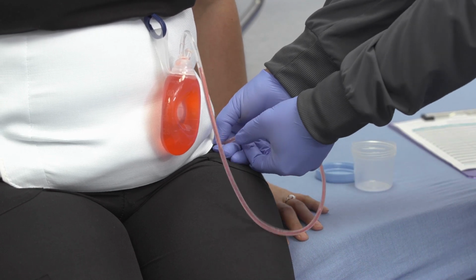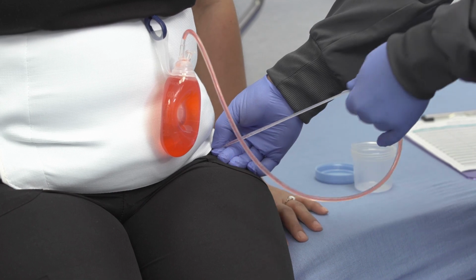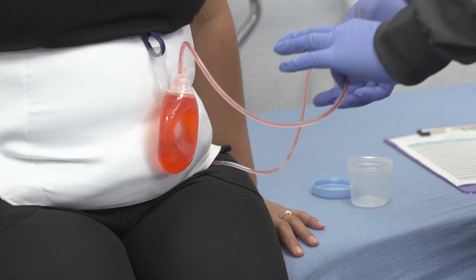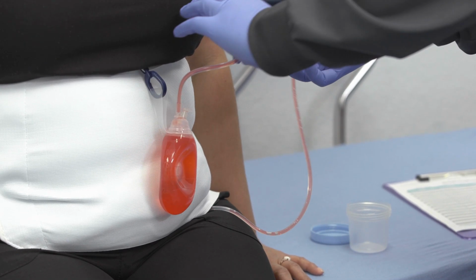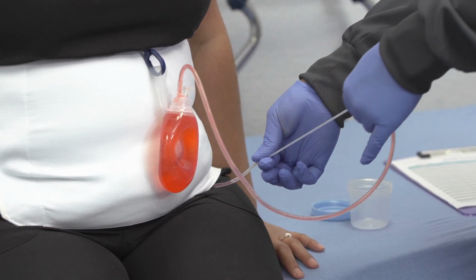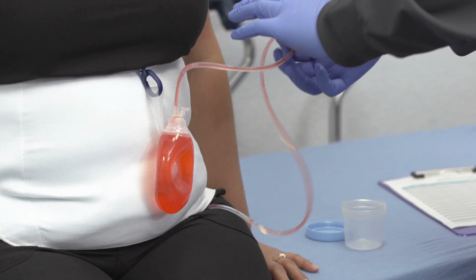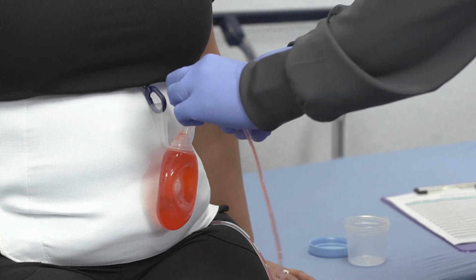With your other hand, you are going to come down. You are going to lightly pinch, squeeze, and pull back on the tubing. You're going to do this all the way down the tubing, all the way to the bulb. You are going to want to do this 1 to 2 times, twice a day, just milking. As you do this, you should notice the fluid moving from the tube to the bulb itself. And again, you want to milk this twice a day, morning and evening.